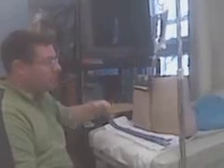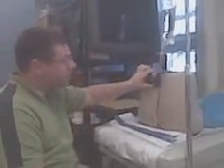Alright, this is a spinal insertion, and Charles will demonstrate for us the technique we were taught by Laura. So, it's on you. Well, if I recall properly. We want to start by letting the patient know who we are. Hi, I'm Chuck. I'm a nurse anesthetist, and I'm going to be placing a spinal catheter in your back for pain control.